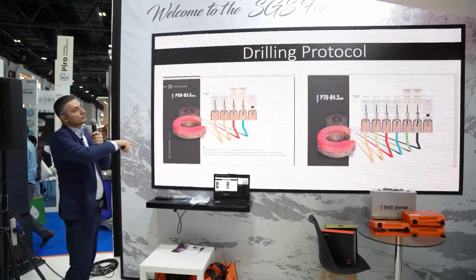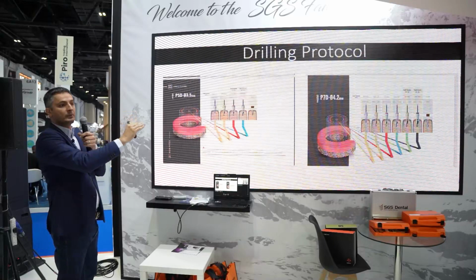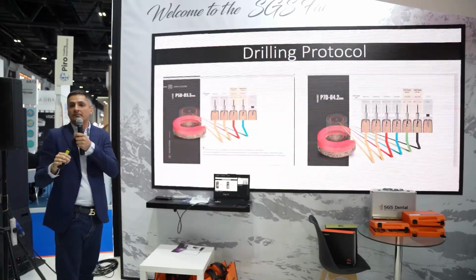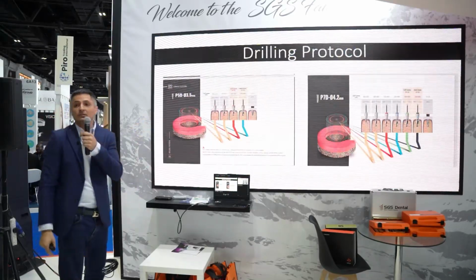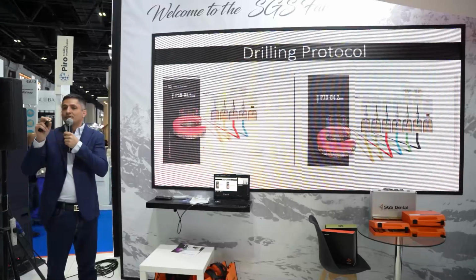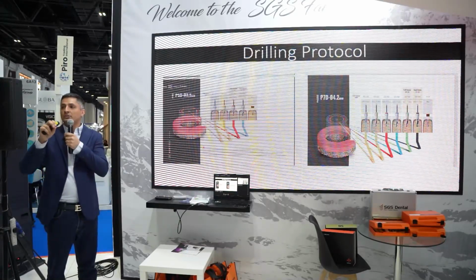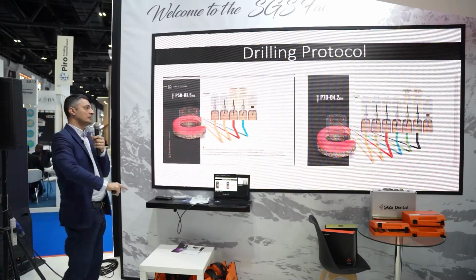For the 4.2, the last drill for the hard bone, I forgot the soft bone. The hard bone is our nightmare. The mandible is our nightmare. For the 4.2, they told us to do the 4.0 last drill. I do not agree. You also have to do a cortical drill, in the maxilla and in the mandible.